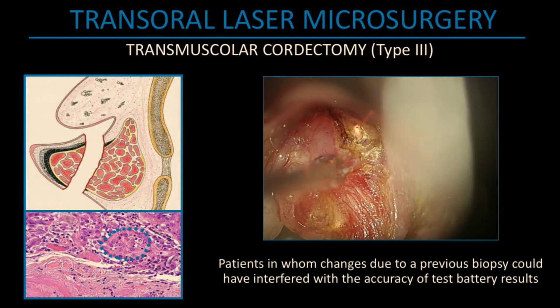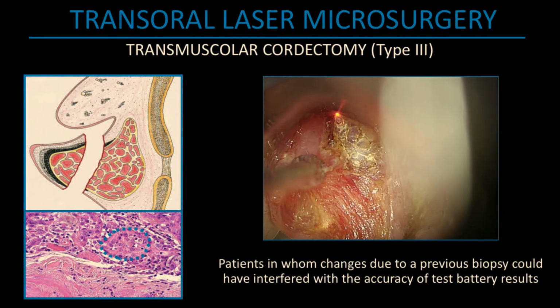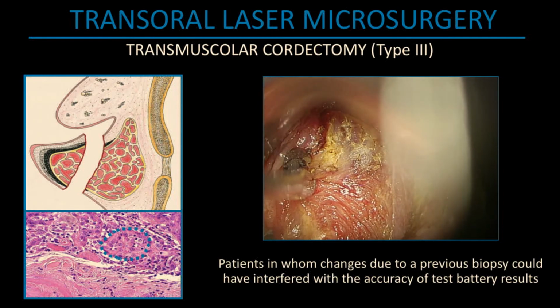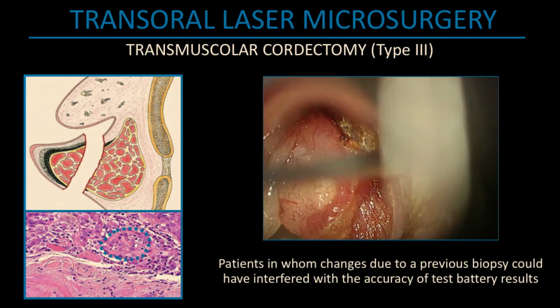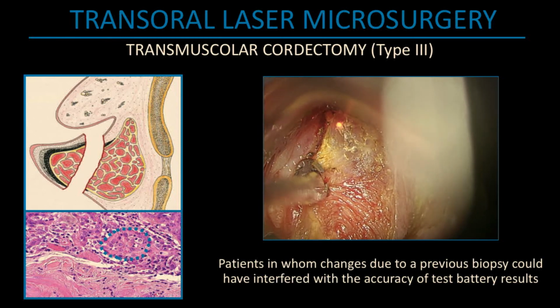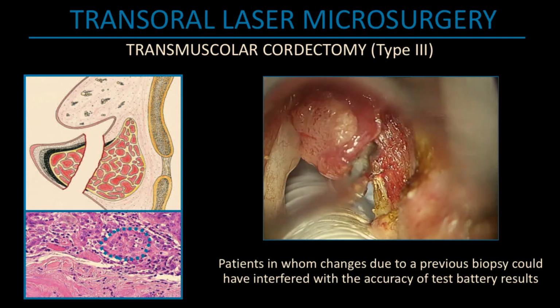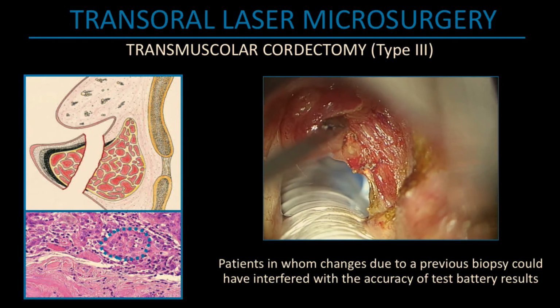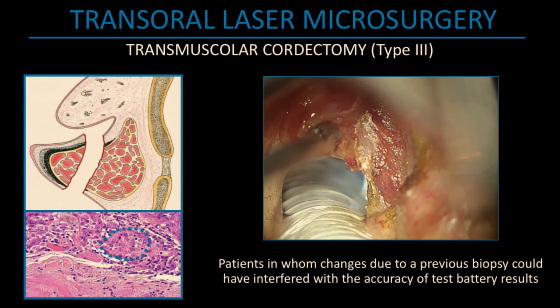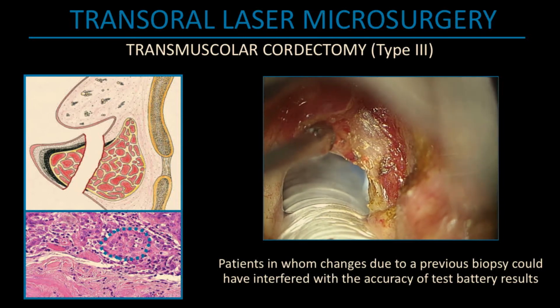And it's important also the interaction of the laser with the tissue. If you have not carbonization, usually you are cutting the healthy tissue. It makes a difference when you cut healthy tissue or tumor. This is the concept introduced by Steiner from Göttingen in the piecemeal chordectomy for bulky tumor. The different interaction between laser and tumor or laser and healthy tissue.